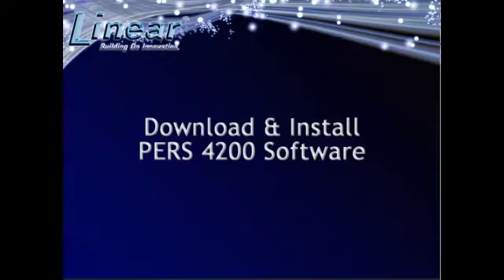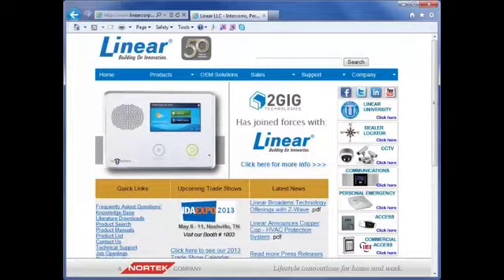Now that we have covered the console, let's take a look at how to download and install the PERS-4200 software from LinearCorp's website. First, you will need to log on to www.linearcorp.com. Then you will have two different ways that you can download the software.